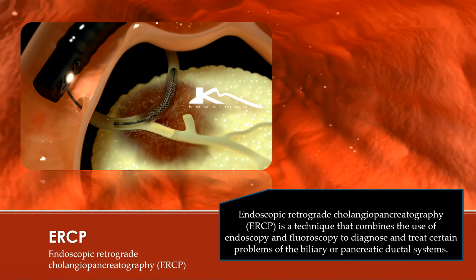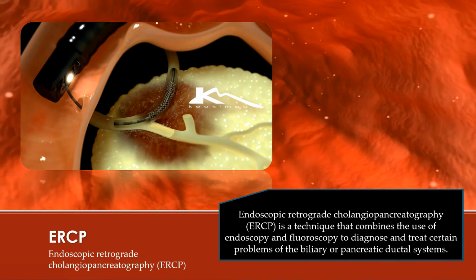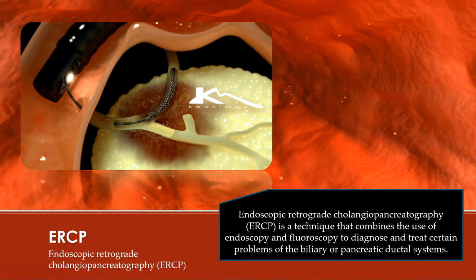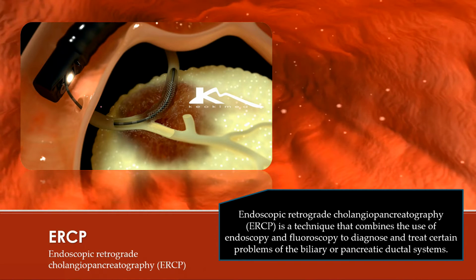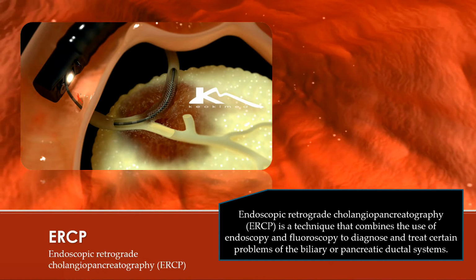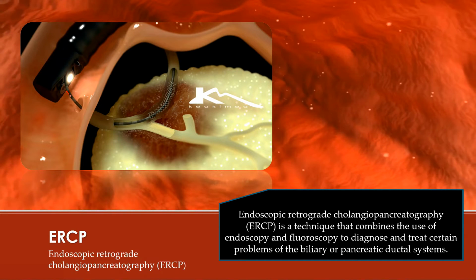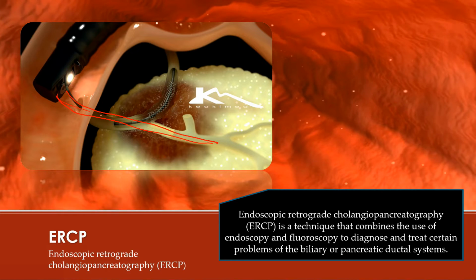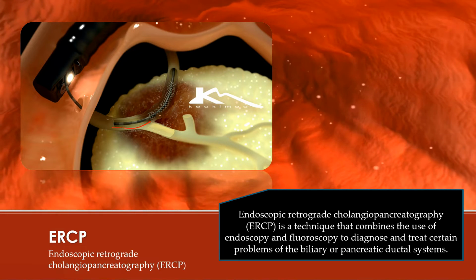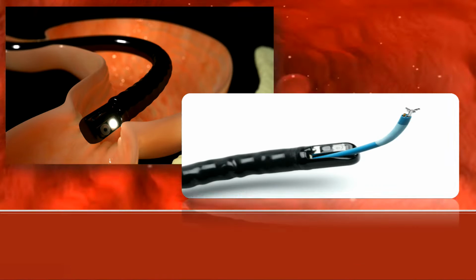The reason is simple: in the patients in whom it is successful, their quality of life is very good. So that is why this is a small risk of complication we are ready to accept. But it is not as innocent, because when you have to do a sphincterotomy, it has to be done at the 11 o'clock position. When you do the sphincterotomy, it has a lot of complications like stricture. Beginners, when they put the stent, initially it enters into the pancreatic duct. They inject the dye also, and the patient gets pancreatitis, cholangitis, stricture, perforation and bleeding. These complications are all there.